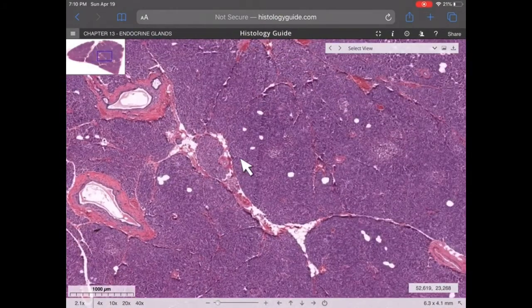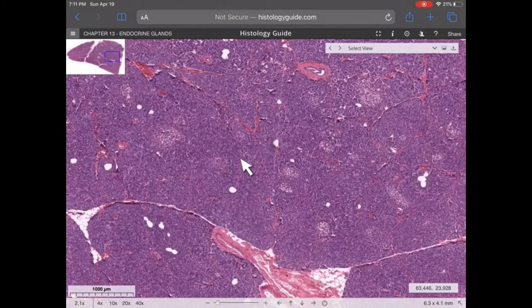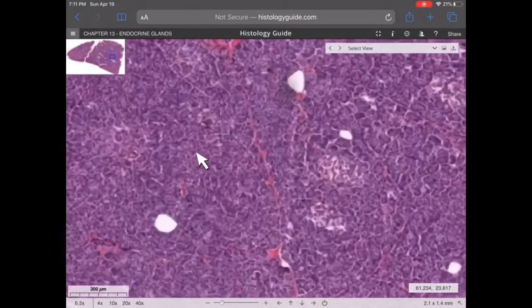The hard thing is to find the endocrine portions. And for this you have to use, remember those magic eye pictures where you stare at them and move them back and forth and cross your eyes, and then suddenly what was once a bunch of sort of random patterns becomes a unicorn or something? The pancreas is kind of similar. So relax your eyes, don't strain or try to focus. What you're going to notice is in the exocrine acini there are light patches. So there's one here, one here, one here, one here, one here, one here, and one here. Each of those is what's called an islet of Langerhans, or pancreatic islet.